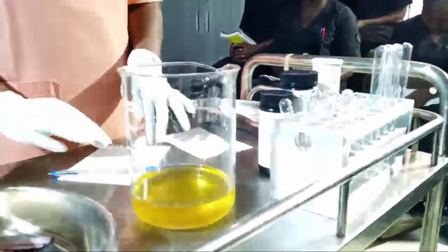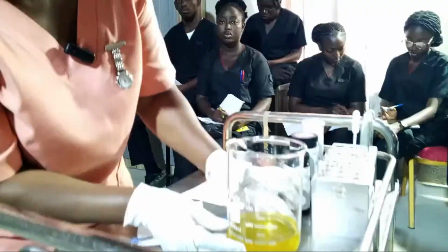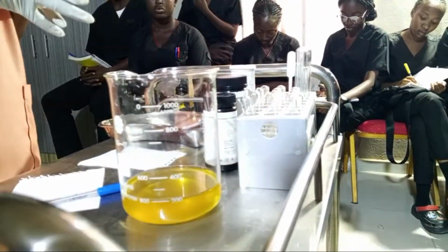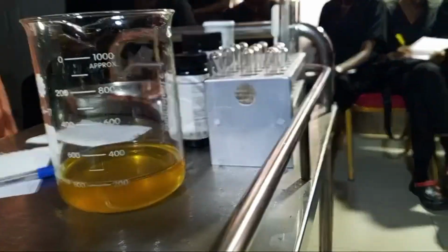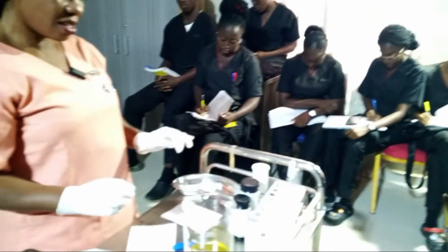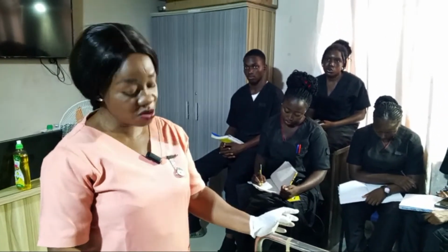And the next thing is amount. You see this beaker, right? What are we having here? We have 200 mils of urine. So we record 200 mils amount, right? 200 mils of urine, isn't it? The next thing is, have I done the reaction? So we have done color, isn't it? And then specific gravity, right?